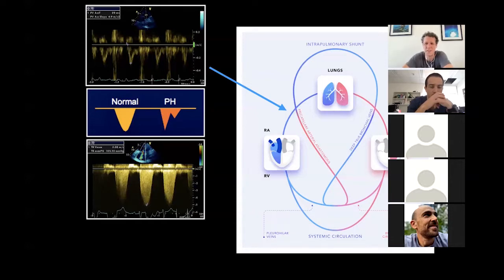Yeah, absolutely. I think another important thing to mention about all the things that we've talked about is that none of these measures are actually really hard. They're not validated in any major way. I think we've all got a handful of observational studies that talk about the accuracy of these things. For example, the one I'm thinking of done by Michelle Slama's group and a lovely guy who works with them, I forgot his name. They've done studies about the accuracy of TR in the critically ill in, like, 60 patients or something. So we should all say that none of these are fantastically well validated.